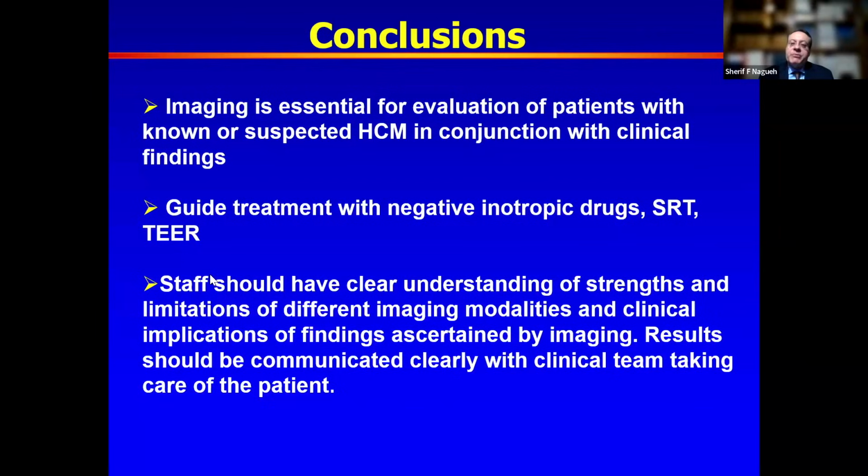So theoretically, treadmill should result in a higher gradient than supine. And I'll say why. In the upright position, there is less venous return than in the supine position. So the preload is higher when someone is exercising in a supine position. The second thing, afterload is also higher with the bike. Systolic blood pressure is higher with bike stress than with treadmill stress. So with higher preload and higher afterload, one would say the obstruction is less likely to be as bad as in an upright position.